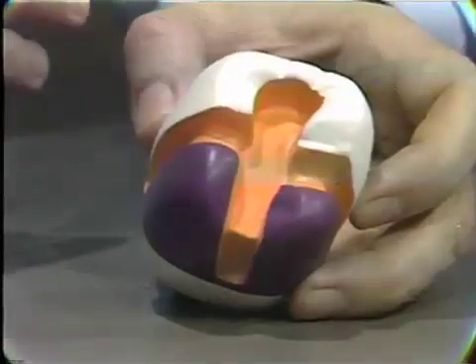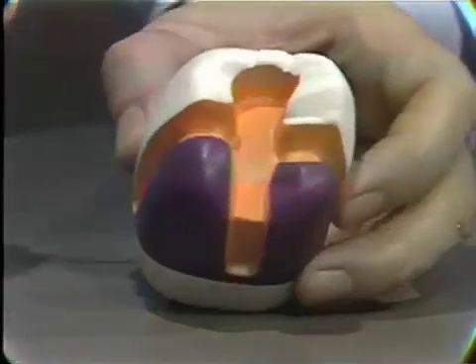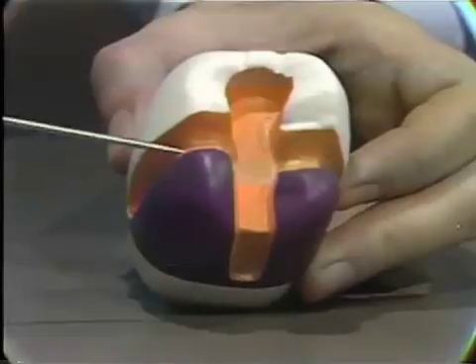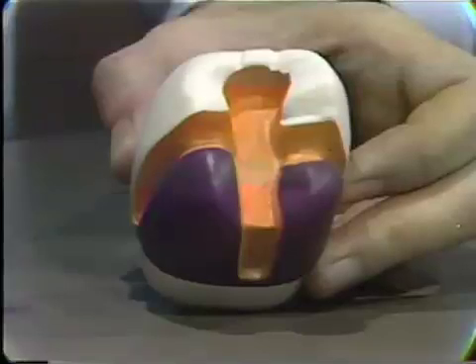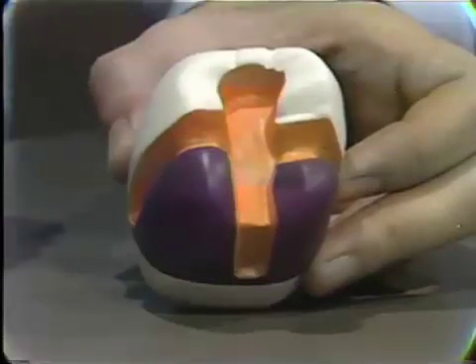All of these situations point to avoiding preparing that surface. And so the three-quarter crown gains its retention from grooves which this time are on the buccal and on the lingual surface of the tooth here. It has an occlusal keyway running through, as you see here, just rather like a class 1 inlay.